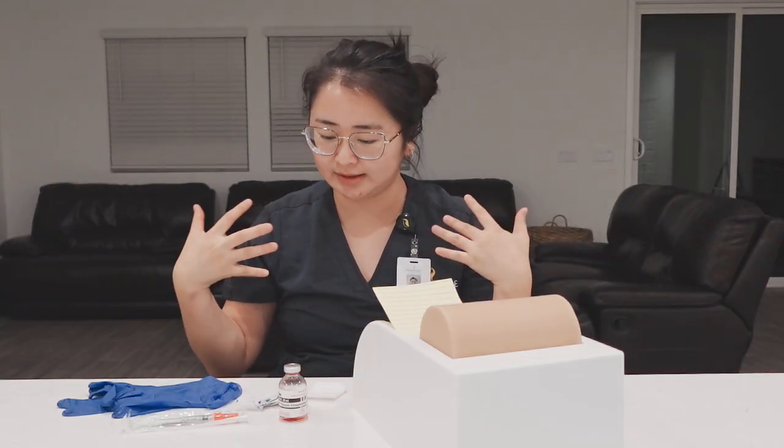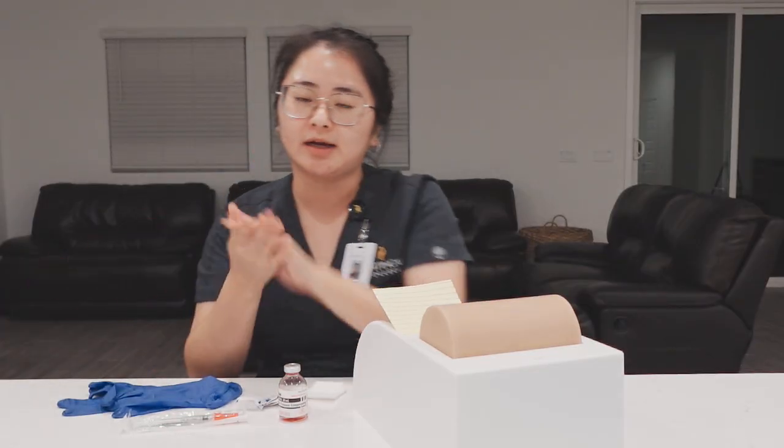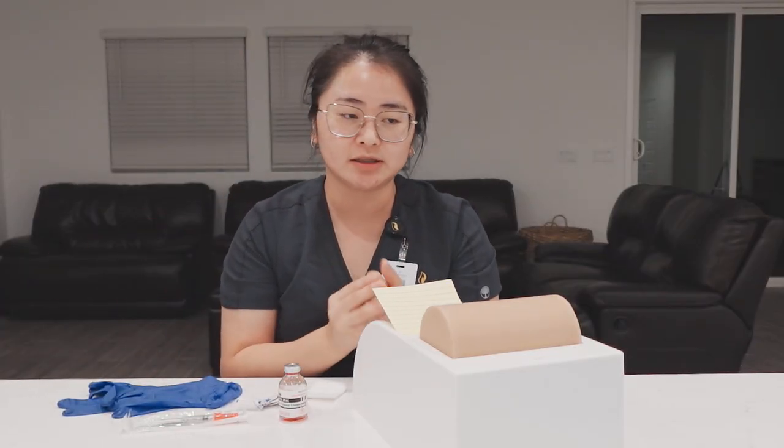Now that I have all my supplies, I'm going to take them to my patient's door, knock on the door, enter the room, close the door, and close my patient's curtain to ensure patient privacy. I'm going to put my supplies down on a flat, dry, clean surface. I'm going to perform hand hygiene and introduce myself to my patient.